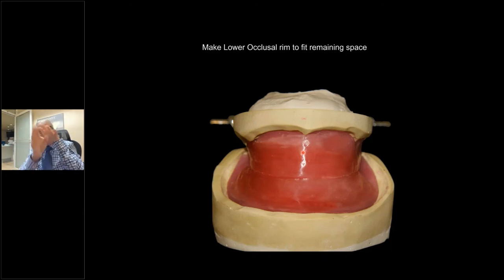When you put these in the mouth, if you've got the lines already drawn and they start moving to the left and to the right, you can see that. And so you'll know to let the patient sit there for a few more minutes, let them deprogram, because they're probably wearing an existing denture that they're overclosed or they're coming forward. So you want to try to just deprogram them a little bit. I love intraoral tracers to deprogram, but a lot of the doctors say they just don't need it. So we don't always do that for you. But if you do want a tracer, I know Kelley Dental Lab can also provide you with an intraoral tracer to deprogram your patient that you can't get a good bite on.